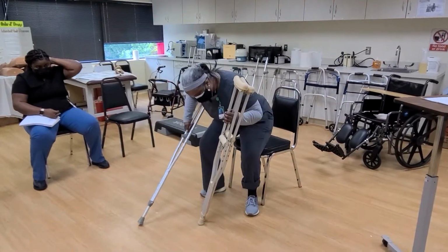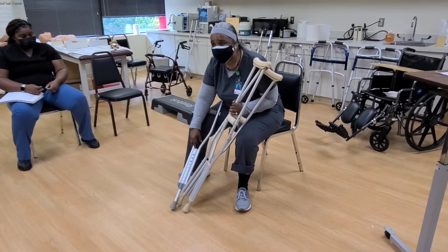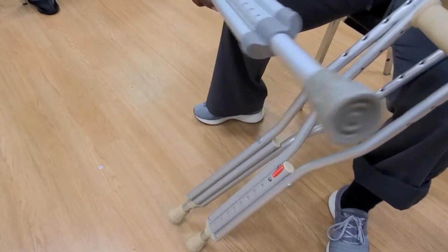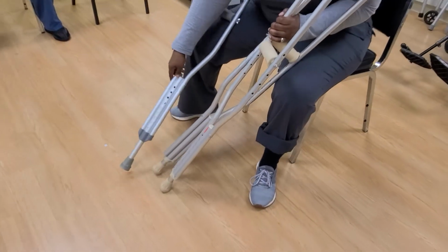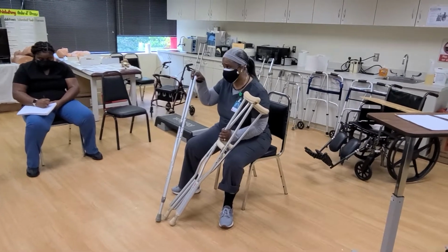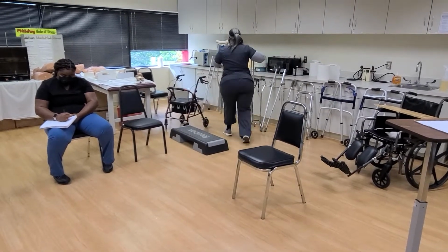And these are a little different because instead of just having the holes where you can press the button, it actually has the height. So you have some that are 5'2" to 5'10", okay? But you also have some that are 5'10" to like 6'4", or you have crutches that are for pediatric patients, okay? So you need to make sure that you pick up the correct crutches for your patient.